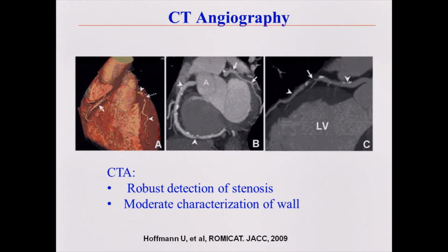At best we have soft tissue contrast, and you can do calcified versus non-calcified, low attenuating plaques versus high attenuating plaques. But when you robustly analyze the ability of CT to characterize a plaque versus histology, it's moderate. There are correlations, it's not that there aren't, but the correlations are moderate.